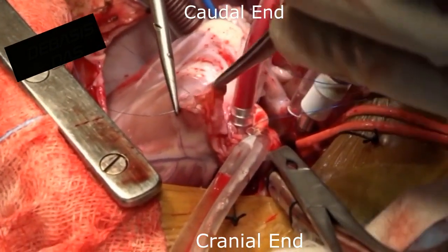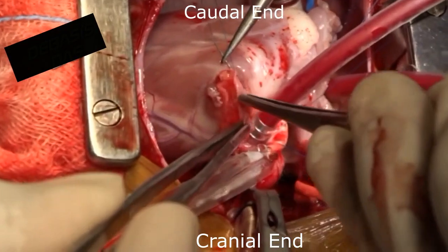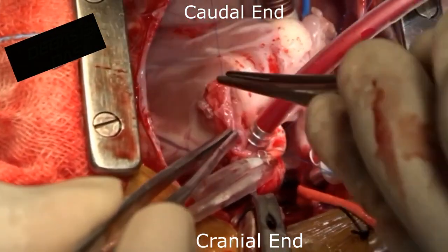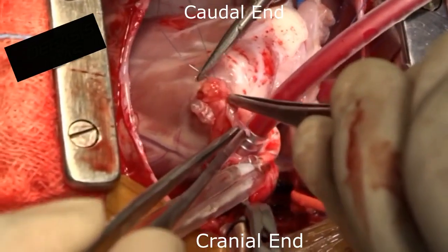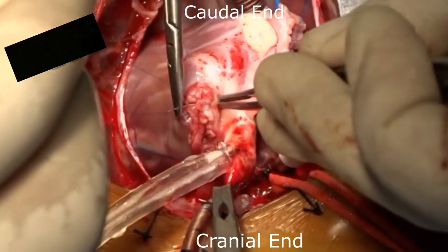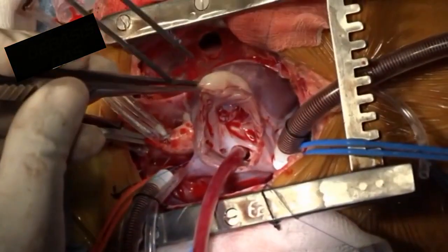The RVOT patch is nearing its completion. These sutures are being taken through the ventriculotomy. It is important to transition from the pulmonary artery to the muscular edge of the ventriculotomy carefully. The patch on the RVOT is now complete.